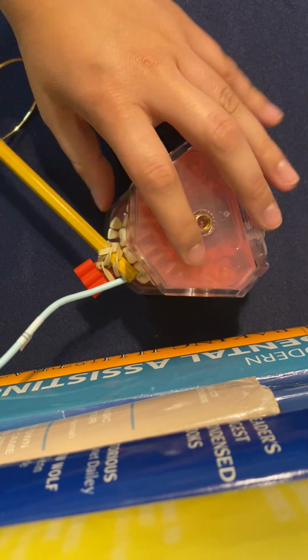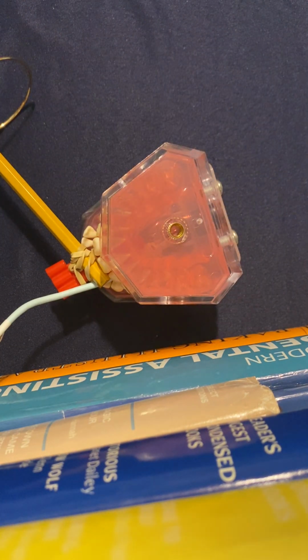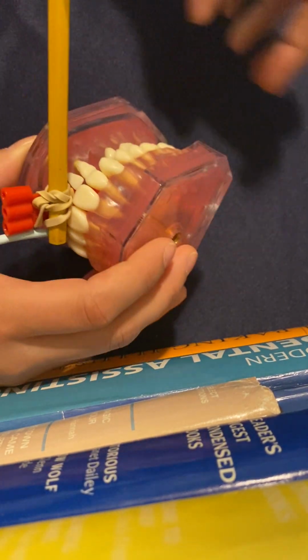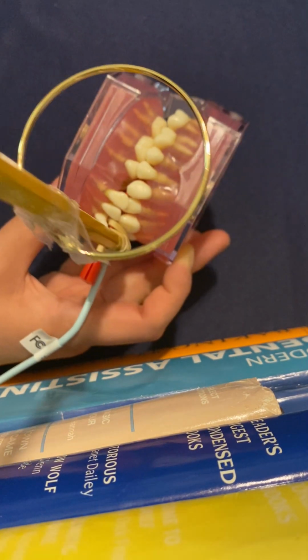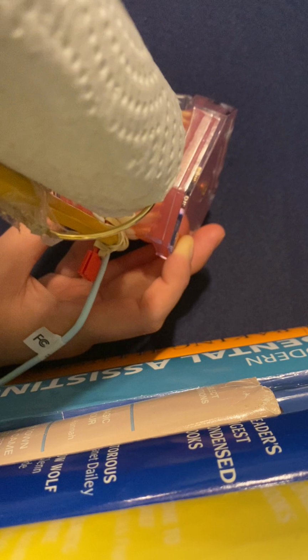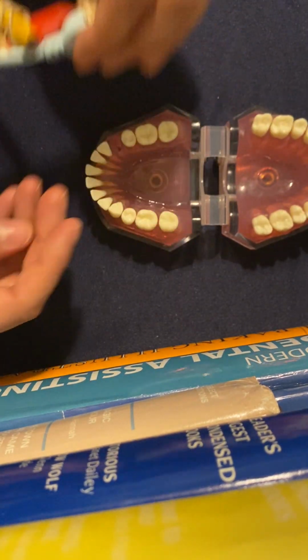So the teeth that you're going to want to see are the distal of the maxillary and mandibular canine, premolars, and the first molar in the occlusion. Because this one, like I said, you're going to want to see there. And the central ray is going to point down from the pupil of the eye to the occlusal plane. So this one you've got to be more in tune with how this plays out, because you're going to see how I have that lined up. You're going to really want to see between those teeth, and definitely get between those contacts.